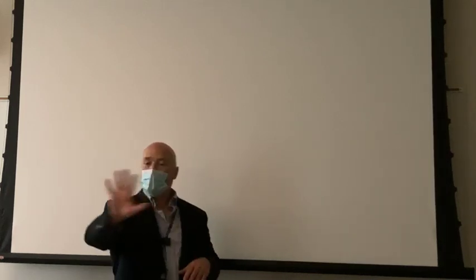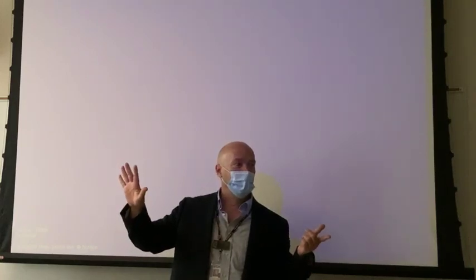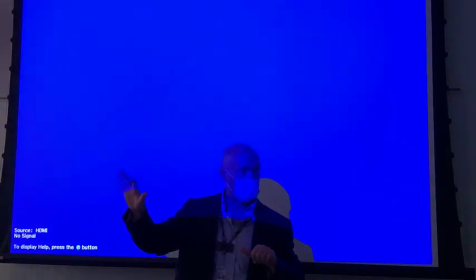Okay? So if you're looking at your own hand, what would include the tip of the finger all the way to the end of the metacarpal? If we're looking, let's say, at the index finger, and you had to look at that and say, I want to put my central ray right there. Looking at your own anatomy, where would you say? That knuckle, okay. But we're not going to say that knuckle on the test. We're going to say what? The proximal interphalangeal joint, right?